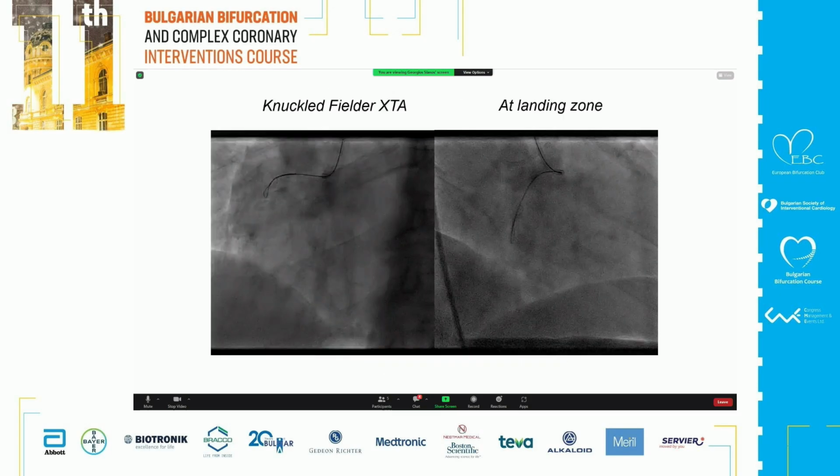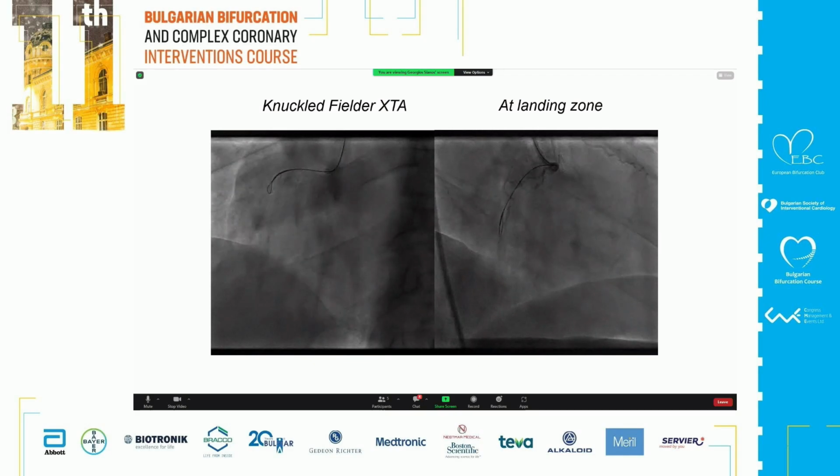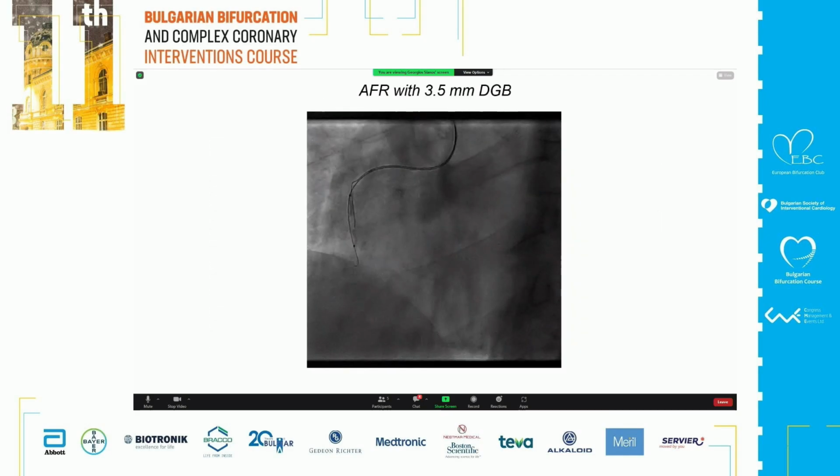But look at that, what is the case here, and that's what we're talking about. That's what I'm telling you. This is the baseline thing, that you go down in knuckle fashion in 5 seconds. You advance the microcatheter, and at this point you do any kind of device-based re-entry or whatever I'm going to show you now. This is the concept of what we are calling anymore wire-based dissection re-entry techniques. You see it in 2 projections. You advance the microcatheter, and then you bring this device here that I show you, the balloon.